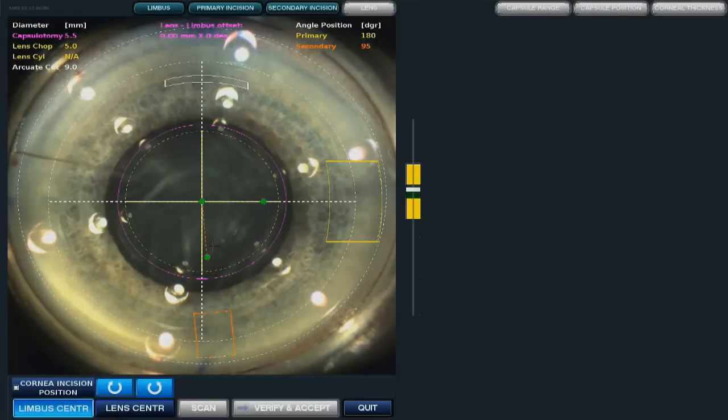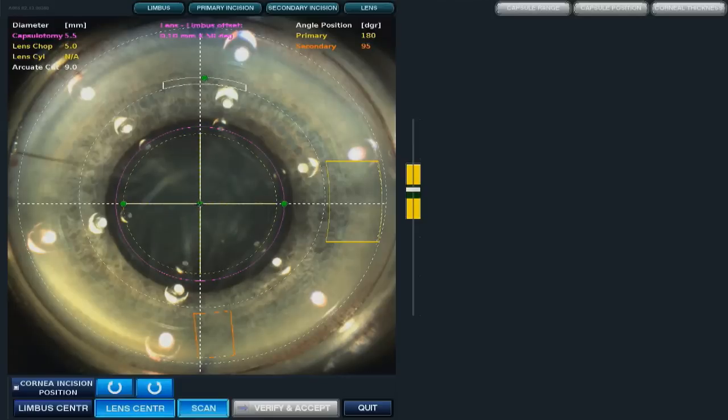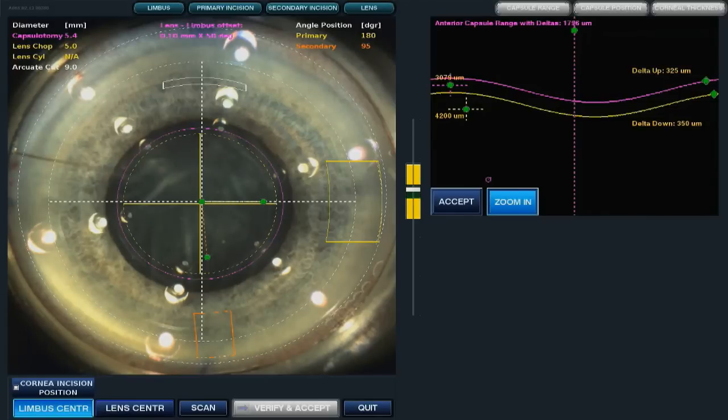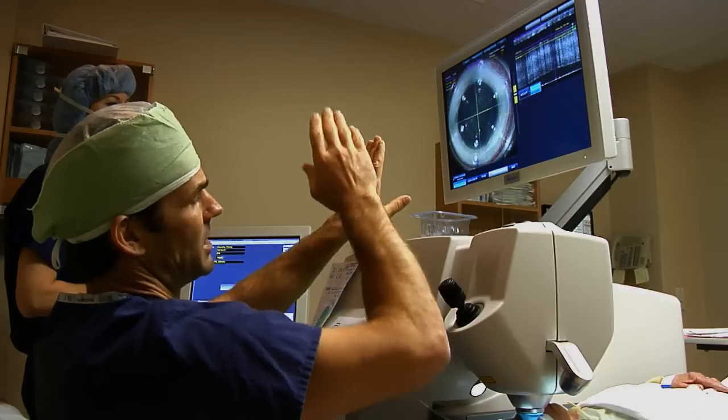I'm going to put the wound right about there, and the port right about there. The capsulorhexis — that's what we open the capsule with. That's what sets the LensX laser apart from IntraLase. That is going to be the opening of the capsule, so when we enter the cataract we need to get in — that will be there. This is a small astigmatism correction. If the pupil were small, I could bring down the capsulorhexis to whatever size I wanted. Now it's scanning the eye — it lays it out like unrolling a piece of paper. That looks good. Everything looks perfect. This is scanning the area for the capsulorhexis and then unrolling it.